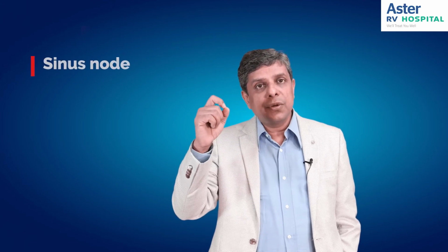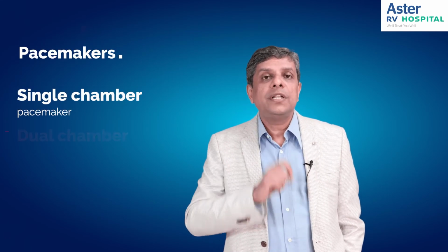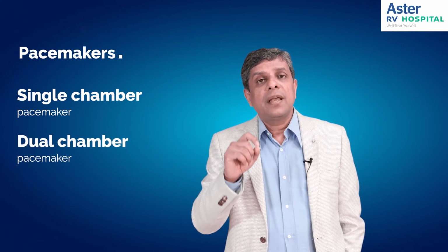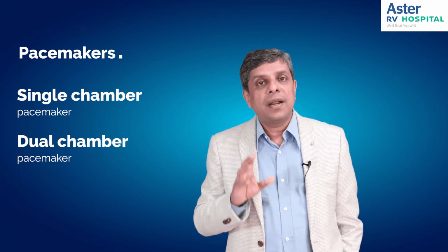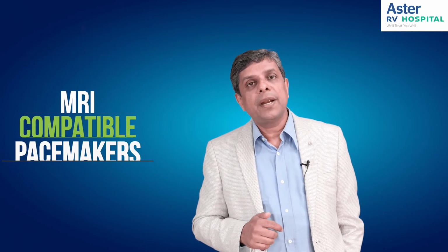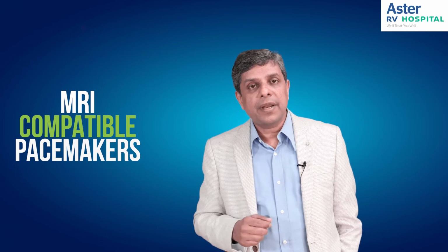So, quickly recapitulating this, I told you that there are some problems where the pulse rate slows down. It can be a sinus node disease or a heart block. In either case, when the pulse becomes very slow, the patient can develop symptoms. To overcome these, pacemakers are used, and they can be single chamber or dual chamber pacemakers. These pacemakers detect the functioning of the heart. If the electrical impulses of the heart become slow, they provide the impulse so that the heart doesn't stop for a long time. And lastly, I told you that there is a new advance in pacemaker technology called the MRI compatible pacemaker, and that is now used for most patients because these patients will require an MRI at a later time.